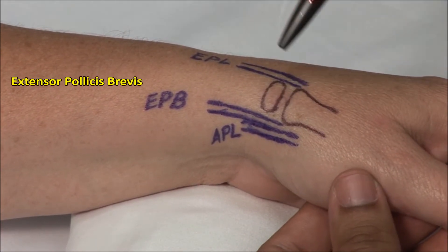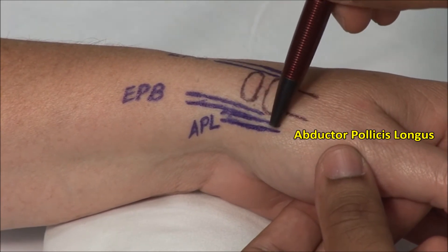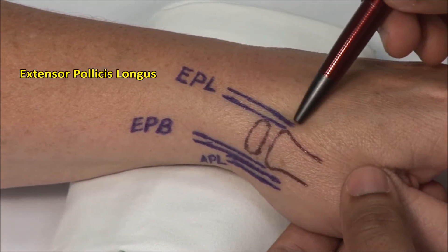The snuff box is bordered by the extensor pollicis brevis and abductor pollicis longus tendons on the volar margin, and the extensor pollicis longus tendon on the dorsal margin.